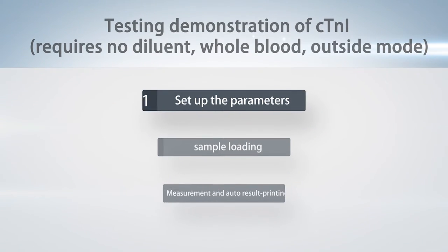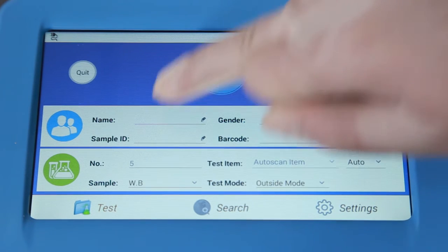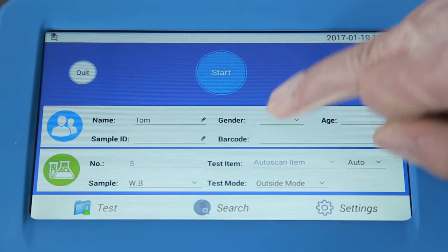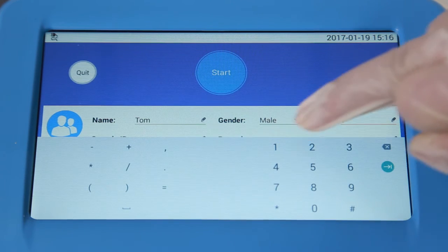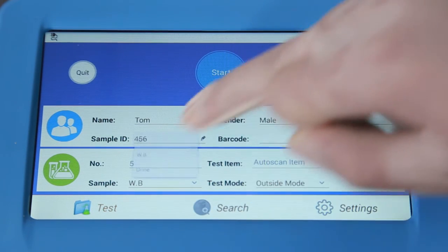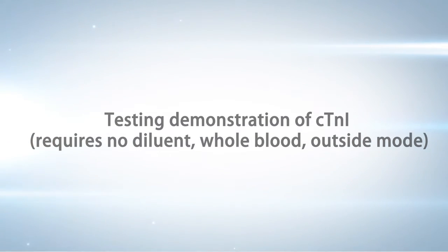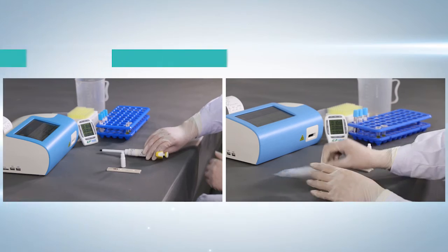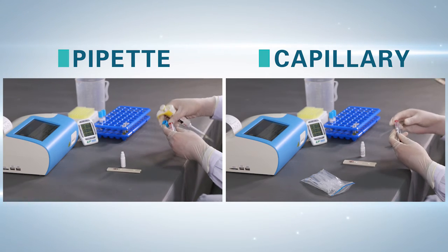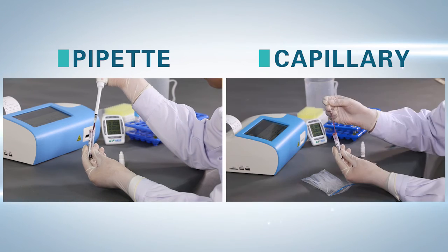Testing demonstration of CTNI: Step 1 — Set up the parameters on the main interface. Input patient information including name, sex, age, and ID. Choose whole blood and outside mode. Step 2 — Sample loading: take 100 microliter sample with a pipette or capillary.